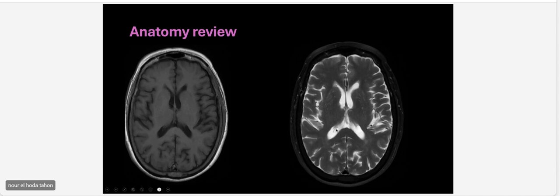You can see some hypointense signal. Do you know what this is? The choroid plexus. Yes, that produces CSF. So that's normal to see here. In some people, or all people, you can see it's calcified. Sometimes you can see something prominent. It's hypointense. Is this a lesion? No, it's just a calcified choroid plexus, and that happens.